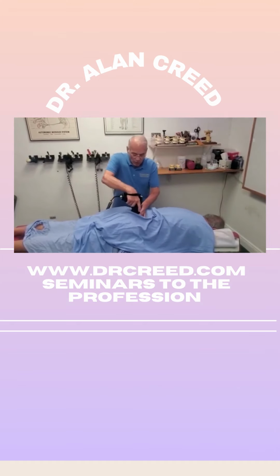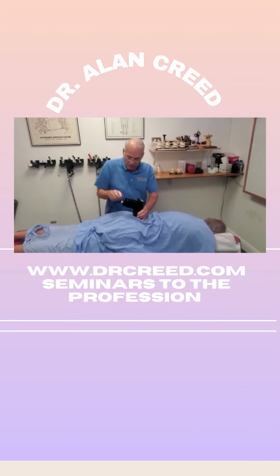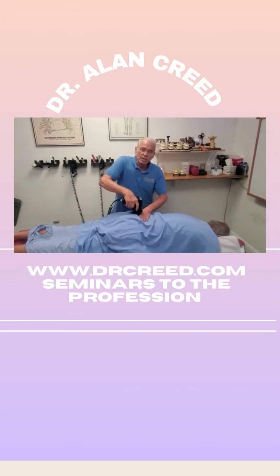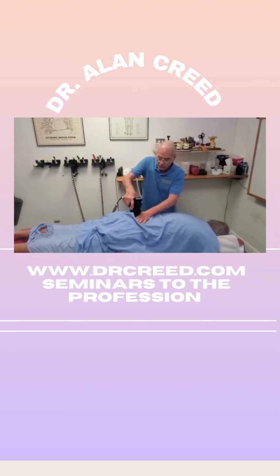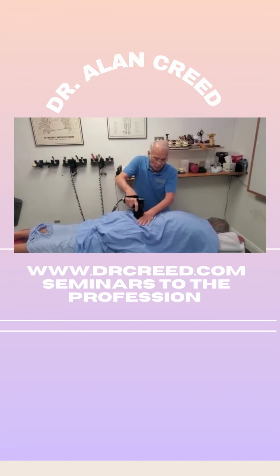Now, I also want to stimulate this area. Cerebral spinal fluid is coming from down here in the sacrum, so I'm going to turn this way up here and give this person a wake-up boost. I'm going to help him fire up better energy in his body. So this is a very nice unit to utilize because you can do multiple things with it.